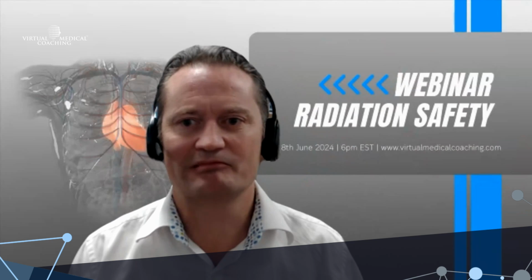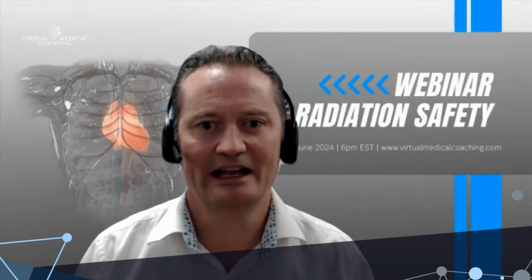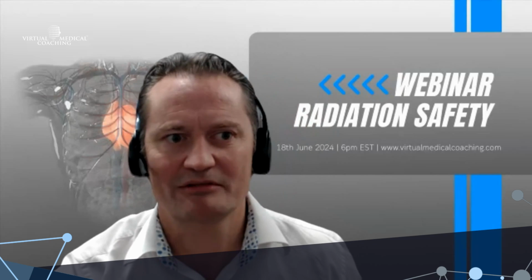So say one of the scrub nurses, they should be beside the femoral access with the surgical table beside them. But for example, if they take a step to the other side of the table, they can see their pelvis dose drop dramatically. Now that's something that they can do. Or the anaesthetist to the other side of the anesthetic machine when the tube is in a lateral position pointing in one direction or the other. And you're like, with these tiny changes, I can see the difference it makes to me. That's the carrot. That's how you're going to get people doing things. It's not saying to them, do fewer operations every year or something.